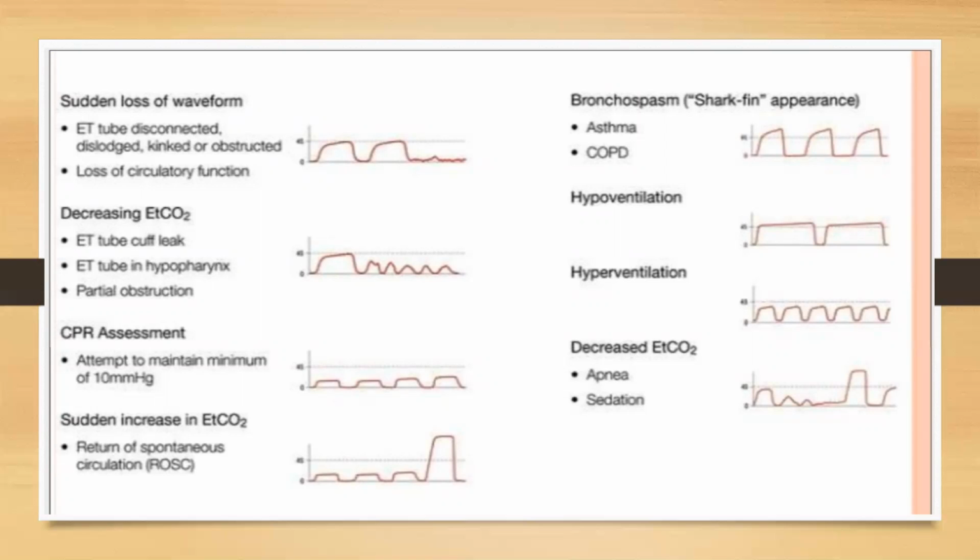The next graph is for hypoventilation. The next waveform is suggestive of hyperventilation. A decrease in EtCO2 trend value on the waveform is suggestive of apnea or sedation.